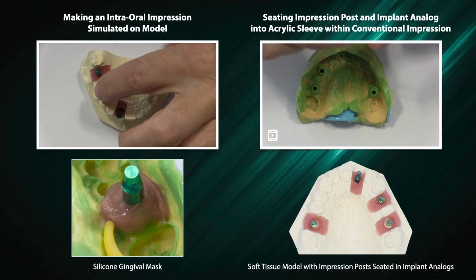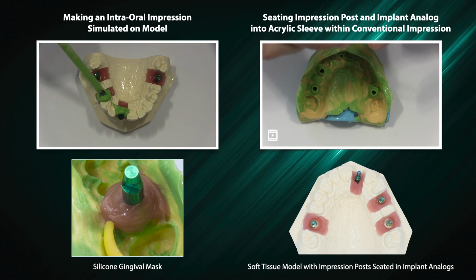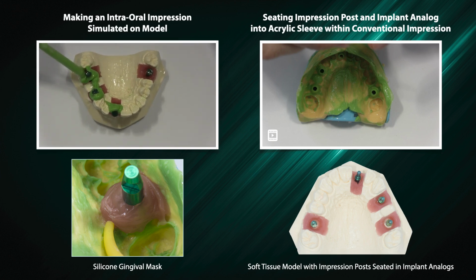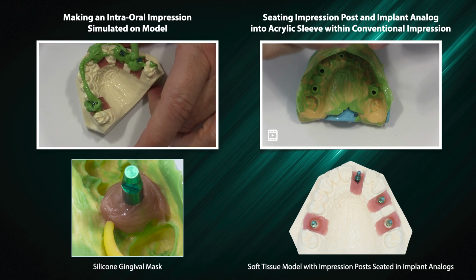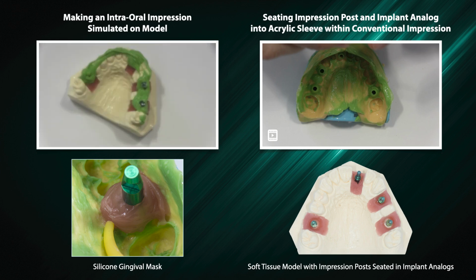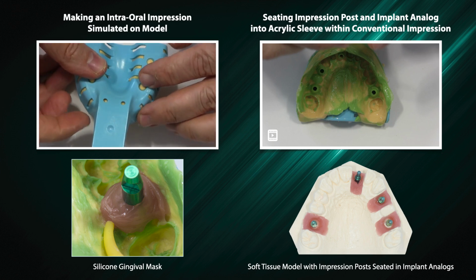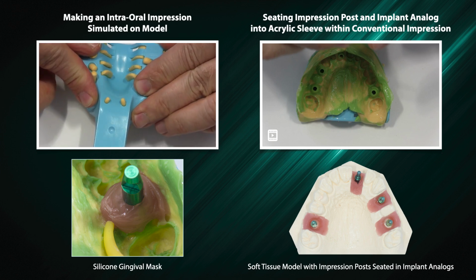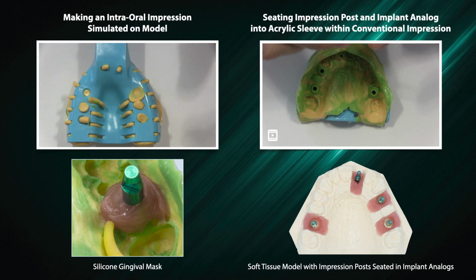Making an intraoral impression simulated on model. Seating impression post and implant analog into acrylic sleeve within conventional impression.